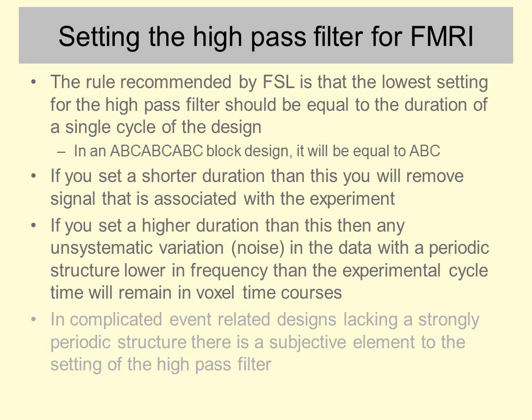Now the difficult case is where you've got event-related designs that are a bit complicated, so you've got sort of 4 or 5 different types of event, and they don't happen in a kind of ABCDE structure. Let's say A is less frequent than the others, and so you don't get an A until you've had about another 15 stimuli.